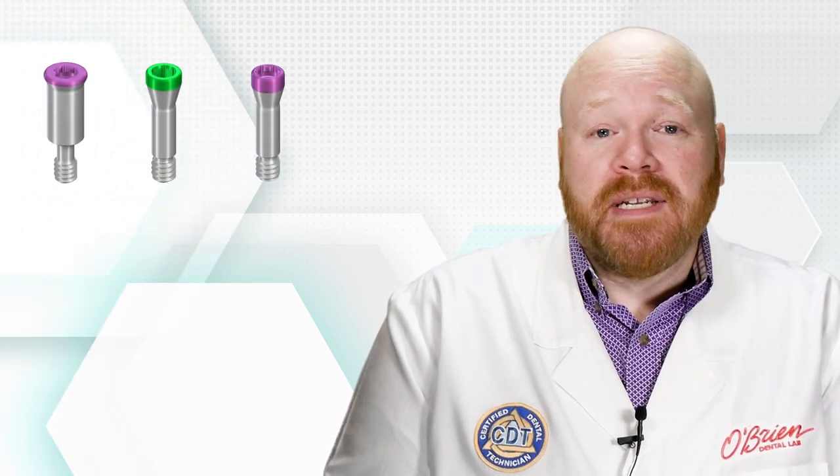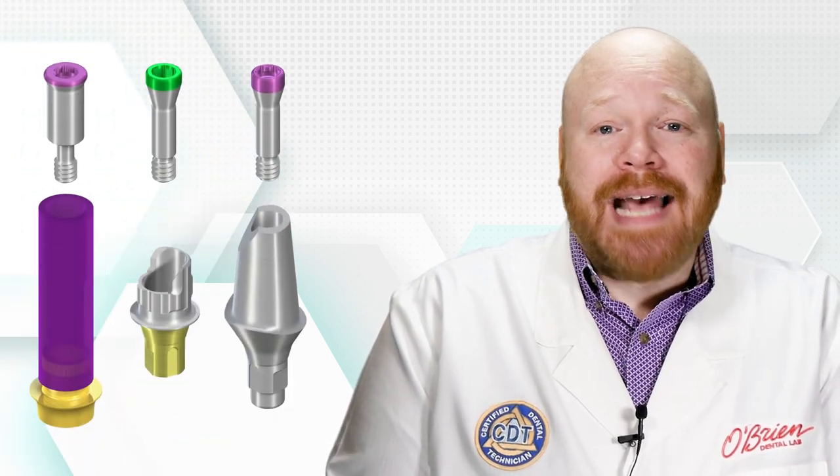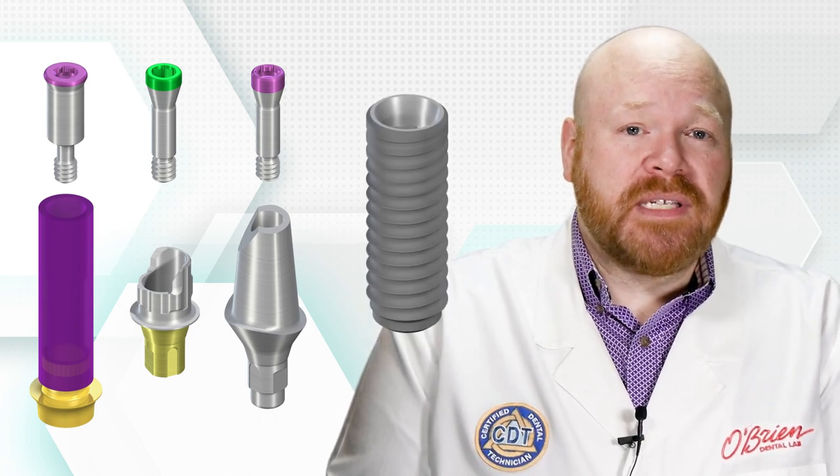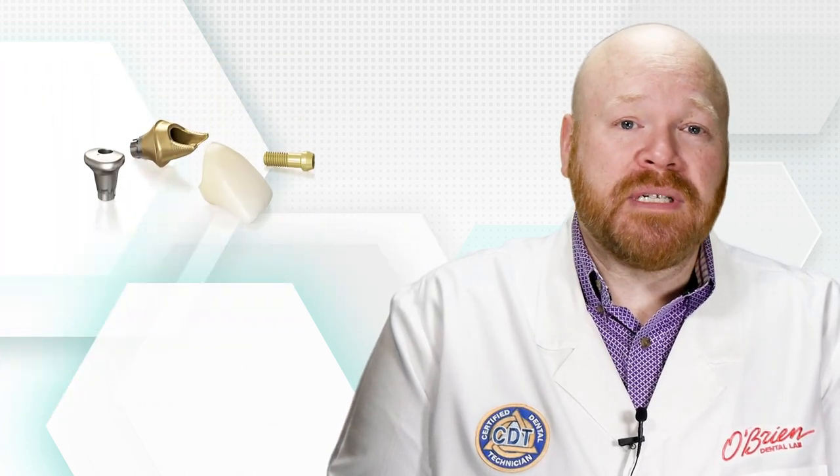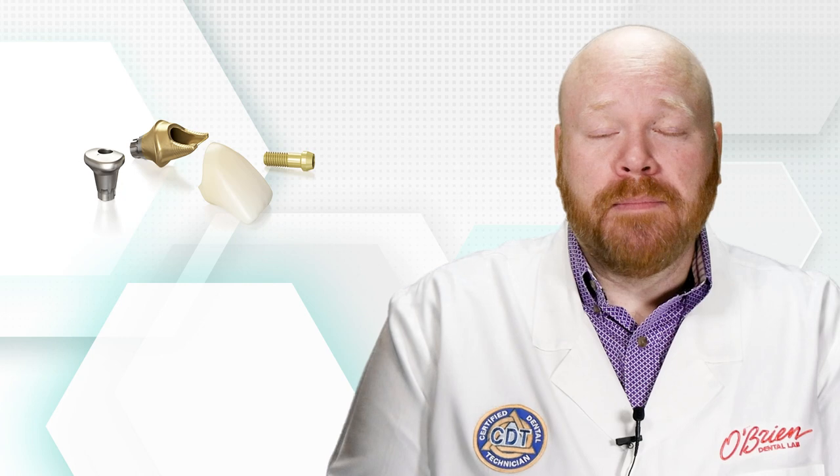Every other aspect of the screw design is dependent on the design of the abutment, and this is exactly why there can be so many different screws for the same implant platform.